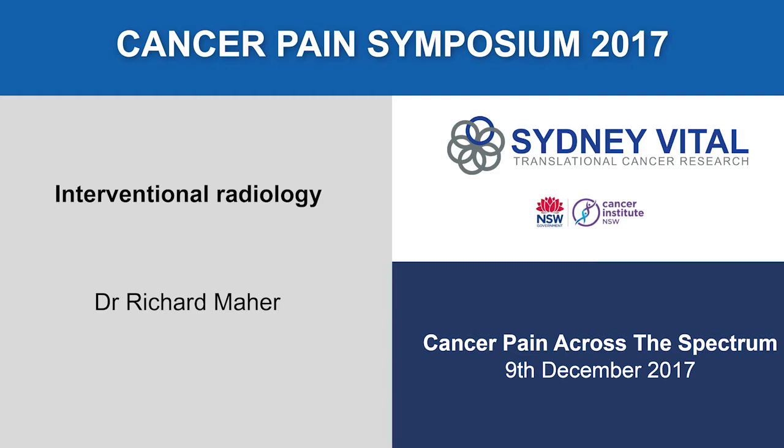Also, people have used thermal ablation for neurolysis, with radiofrequency ablation and cryoablation. The plexus targets include the celiac plexus, which I'll talk about in detail, but there are a number of options: the superior hypogastric, ganglion impar, stellate ganglion, thoracic and lumbar sympathetic plexus, peripheral nerves, intercostals, and brachial plexus, depending on the patient. Overall there's generally a good response rate of some degree and improvement in quality of life.